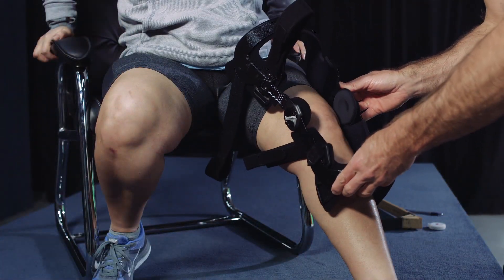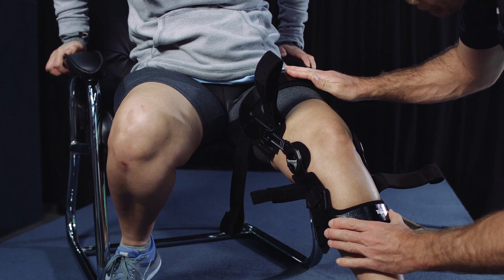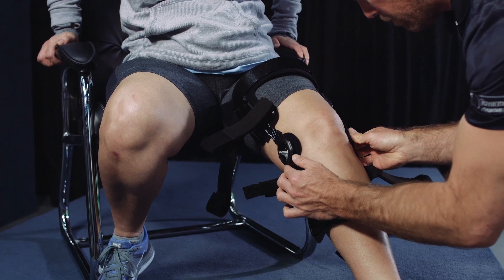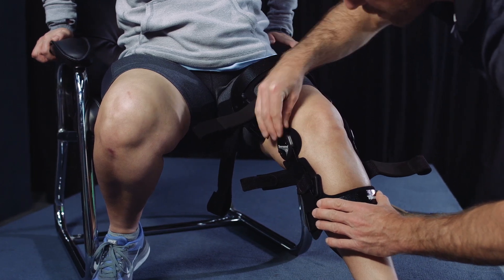With the patient seated at the edge of the chair and the knee flexed to 60 to 90 degrees, position the brace on the leg with the hinges slightly above the patient's anatomical knee center. Ensure the joints are not positioned too far anterior or too far posterior. The ideal position is at midline on the side of the leg or slightly posterior to midline.